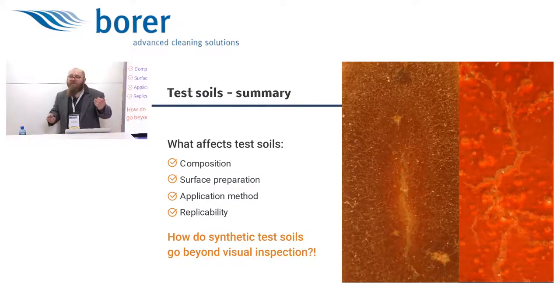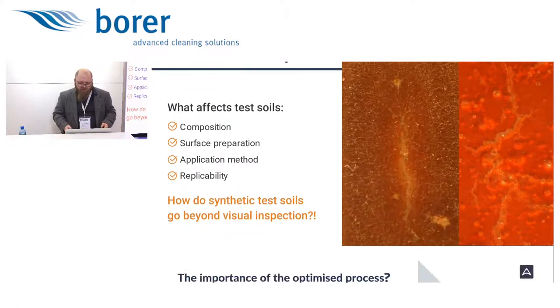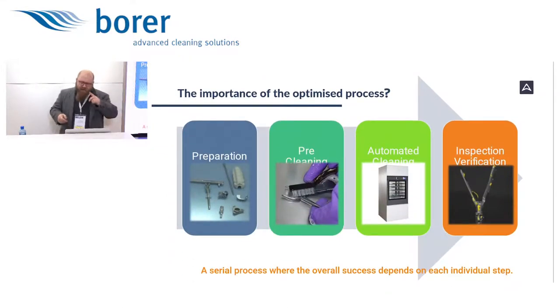So when you have those clean plastic PCDs, I can tell you, that's fantastic. This represents all of your plastic instruments covered in red paint. If you have your plastic instruments covered in red paint, they'll be cleaned. If you have other instruments, stainless steel, covered with blood and tissue, you have no idea what's going to happen to them. And it's also another element.